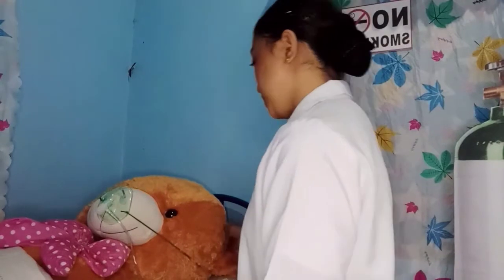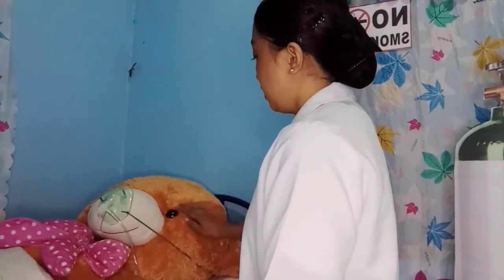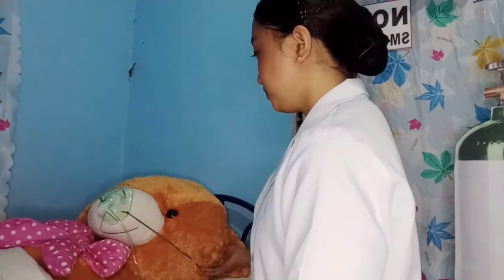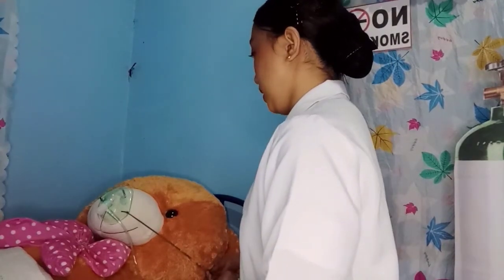Ma'am, try niyo pong huminga gamit ng ilong, then close po natin yung mouth. Ma'am, hindi naman po ba masyadong masikip? Hindi naman po. Or adjust pa po natin? Okay na po ma'am. And then adjust the flow rate to the prescribed rate.